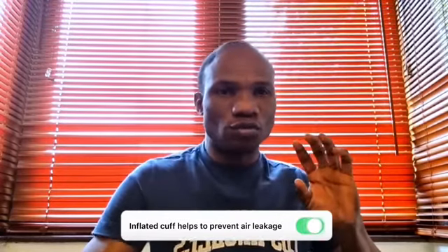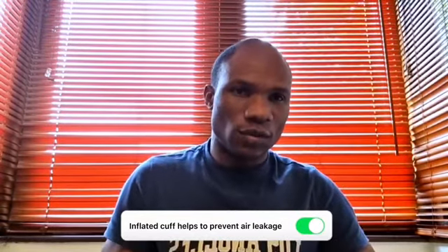The second reason why it's important for the cuff to be inflated is that patients who need positive pressure ventilation must have their cuffs inflated, because when the cuff is inflated, it will prevent the leakage of air. So for instance, if you push air using your ventilator into the patient, you provide positive ventilation for the patient. The air, because the seal has been formed by the cuff, will be prevented from leaking out of the patient. So it's very important.